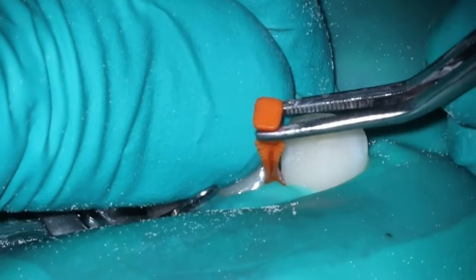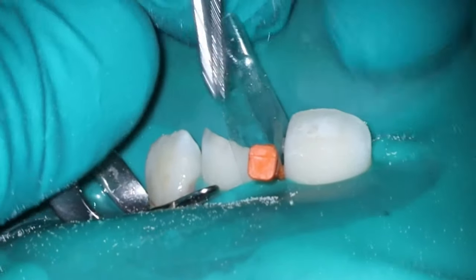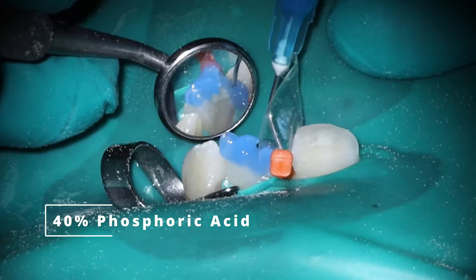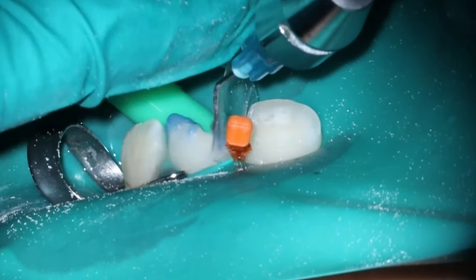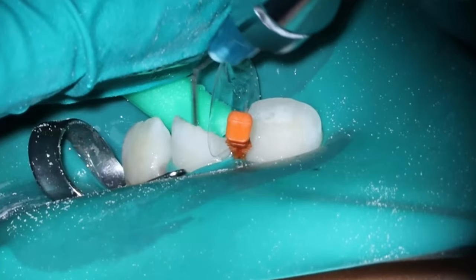I decided to use a wedge here because I couldn't get a really solid fit inside there. Normally you don't have to use wedges with this. I decided to here. This is all the Bioclear system. Go in with our total etch at this point. Now I'm not worried about doing the etch because we have that nice Vitrebond on top of there. It's going to help protect the tooth from any of those negative pulpal effects inside there.